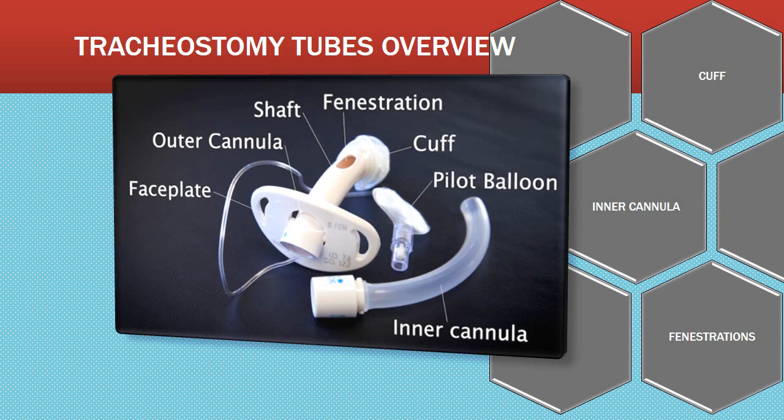One thing I wanted to add is as you get ready to cap a trach because the patient is stable, you want to make sure that you understand whether it is cuffed or uncuffed. Usually when we are discontinuing the trach and we need to start capping the trach, we'll switch the patient to an uncuffed trach.